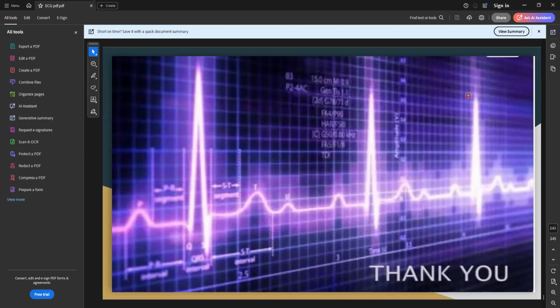Ma'am, in regular practice, which are the most common conditions where we have to note these ECG changes? Okay, I'll tell you. The most common is acute myocardial infarction.